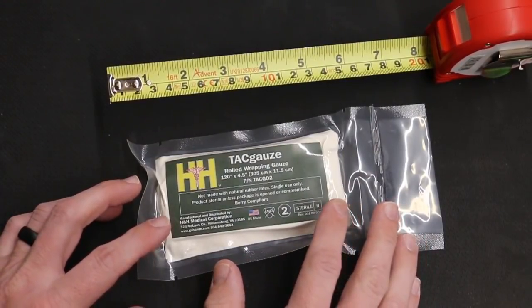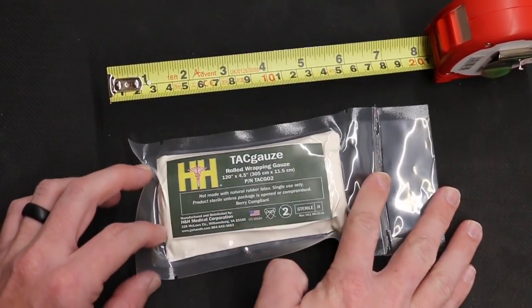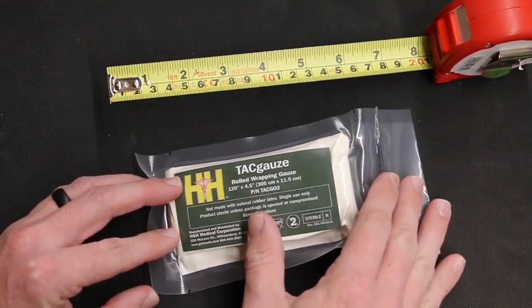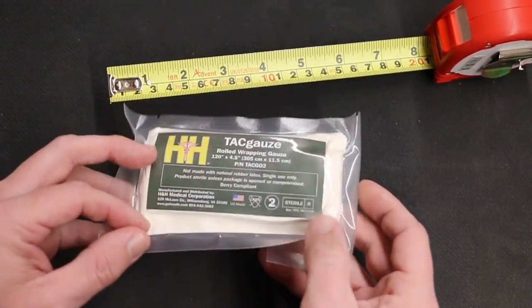Before we open up the TAC Gauze, I'll give you the overall size of the packaging. If you've got it completely laid open, it's about eight inches in length and about a half an inch thick. If I were going to store this in my trauma kit, I would fold it, so you're looking at about six inches by half an inch, and it weighs two ounces.